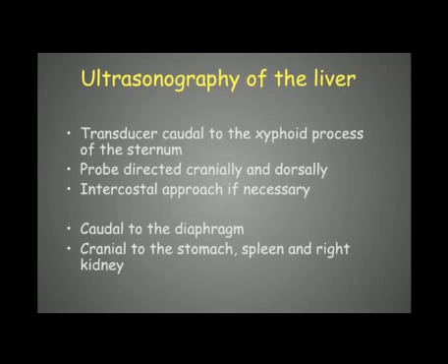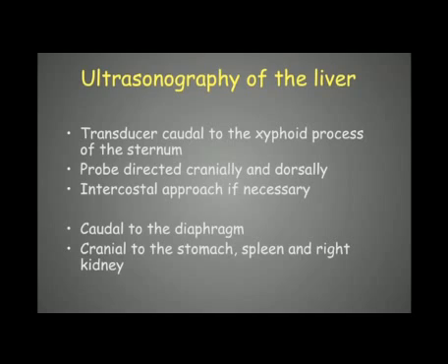To perform ultrasonography of the liver, we place the transducer caudal to the xiphoid process with the probe directed cranially and dorsally, observing the liver from right to left and from ventral to dorsal. We can also use an intercostal approach by placing the probe between the ribs — mostly for dogs with deep chest morphology where the liver sits behind the ribs.